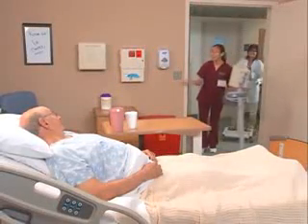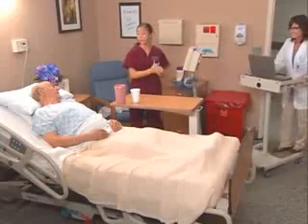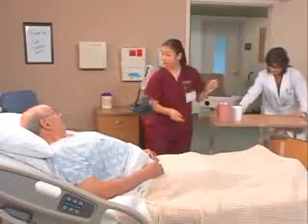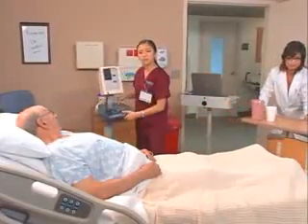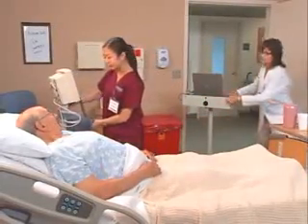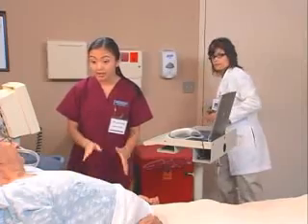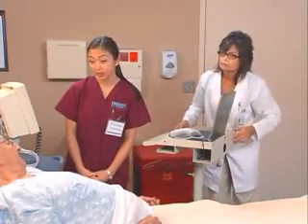Mr. Marlin? Hi, remember me? I'm Rose, and this is Miss Varga, my nursing instructor. I'm going to be taking your blood pressure, okay? Sure. You think it's any different than when you took it earlier? Well, you received that new medication for your blood pressure, right? Yeah. It's been kind of high lately. So we'd like to monitor how well the new medicine is working. That means several blood pressure readings pretty close together. I'm going to set this machine up to record your blood pressure automatically for the next hour or so.